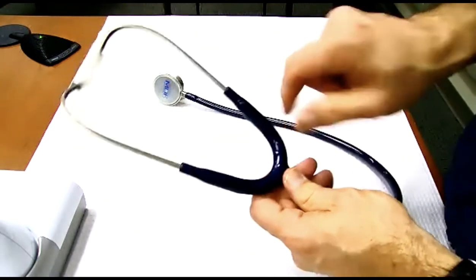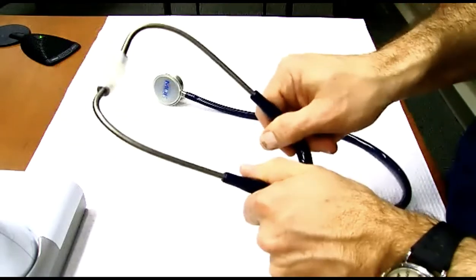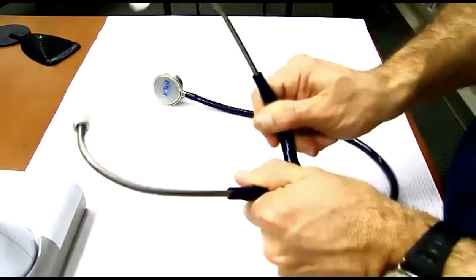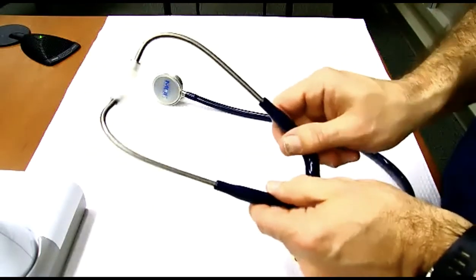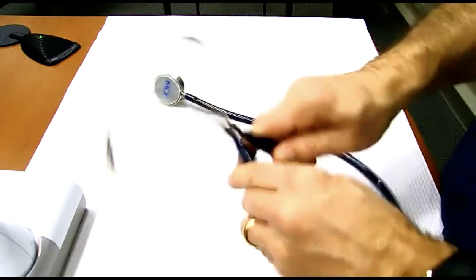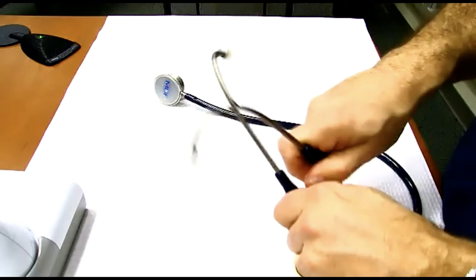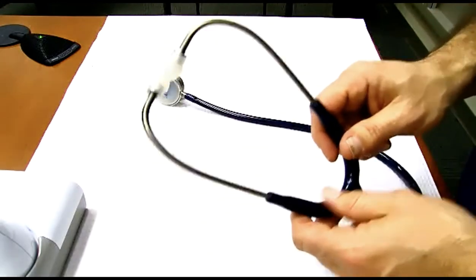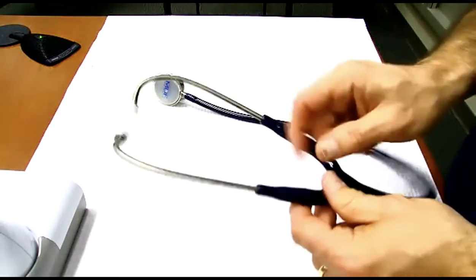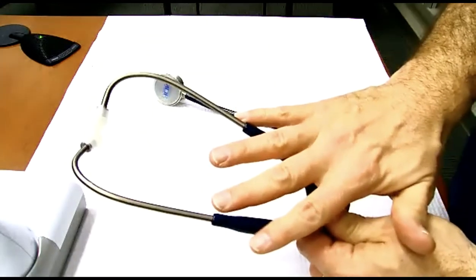There is a piece of metal inside this little neck piece right here. So all you need to do is pull it away a couple of times, bend it like this, and that'll open it up, loosen it up a little bit. If it's too loose, then just go the opposite way. Go this way a couple of times, and that'll make it a lot tighter. So you can open it or tighten it until it fits snugly, but not too tight or uncomfortable in your ears. So make sure you've got that set in a way that works best for you, okay? That's really all for this part.